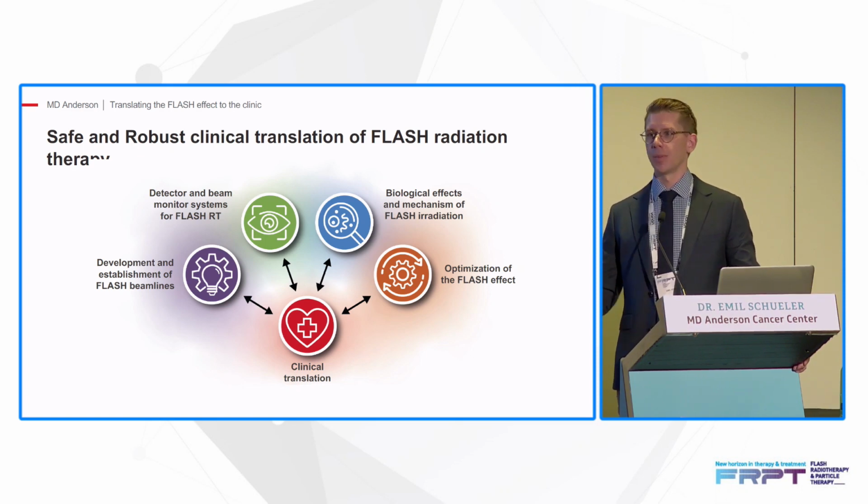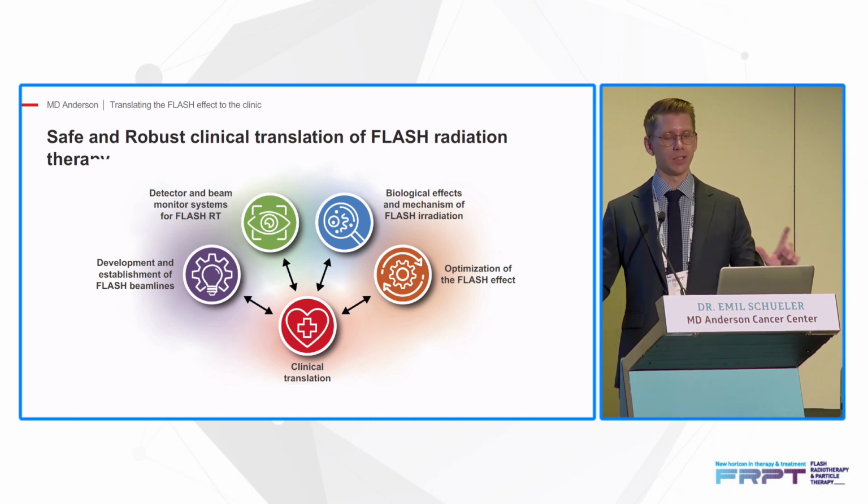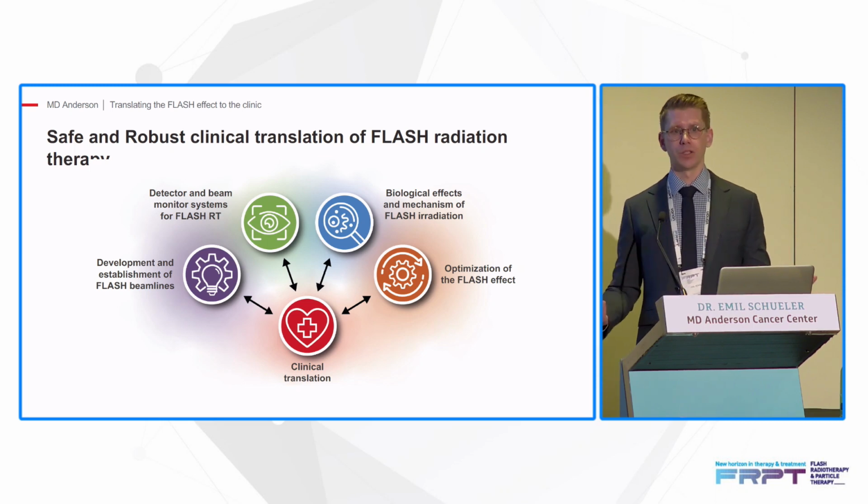And then obviously the optimization of the FLASH effect: whether or not there is an effect based on the pulse structure, which we are starting to see more and more, as well as looking at whether there are differences in the magnitude of the FLASH effect depending on particle type.